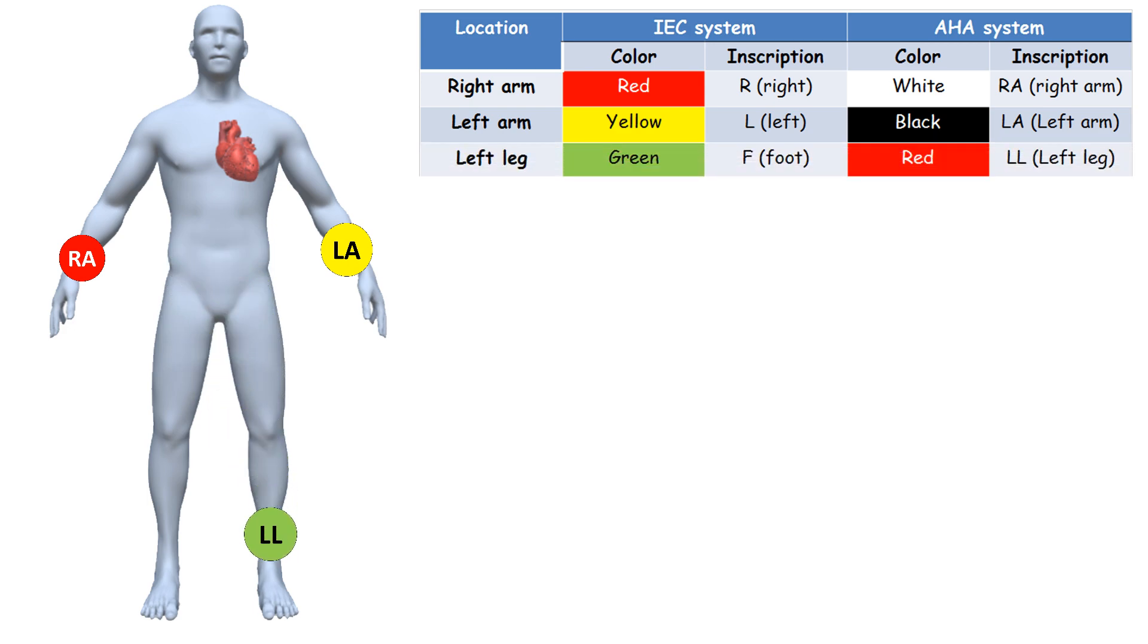LL, often marked in green color, is placed on the left leg on the lower end of the inner aspect of the calf muscle. RL, often marked in black color, is placed on the right leg in the same place as LL.